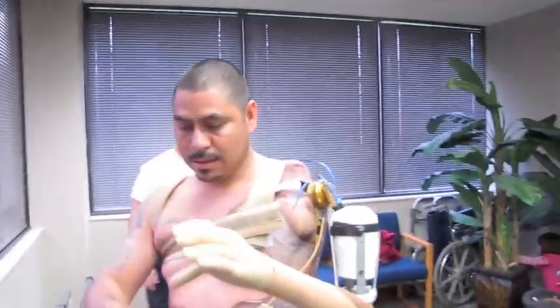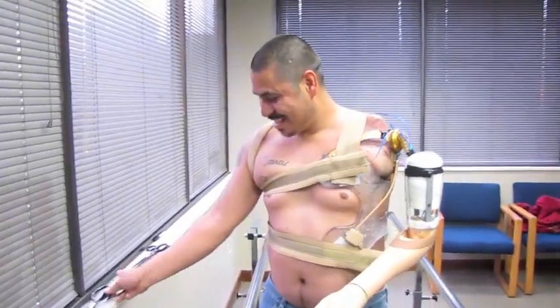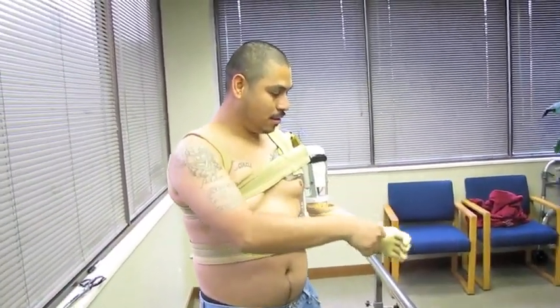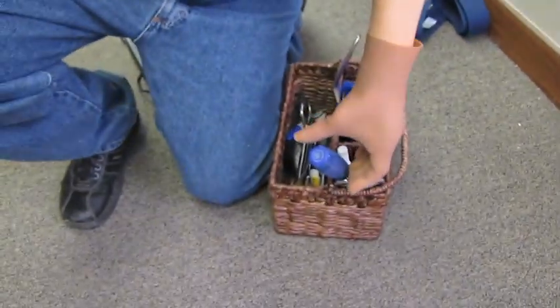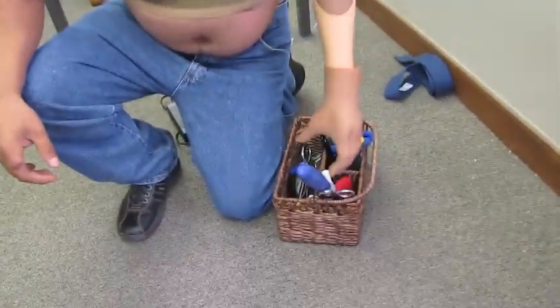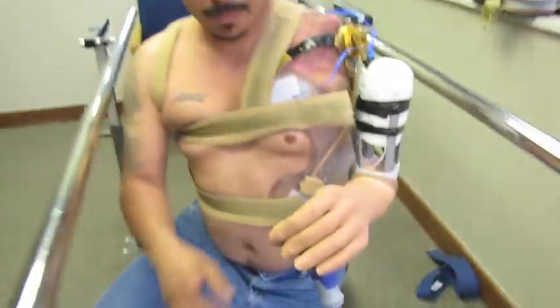Wow, very good. How do you practice, you know? Yeah, that's great stuff. That's awesome. You're really good at this.